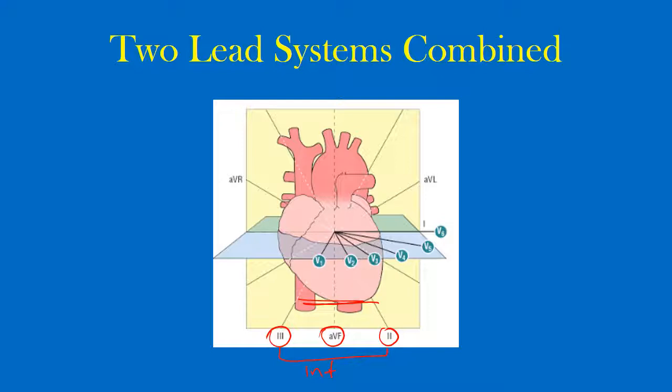So what about the leads V1 and V2? Well, these leads, we just previously discussed, run along the septum. And thus changes in these leads may indicate a septal wall MI, if there's a problem that you see or changes you see in the EKG.